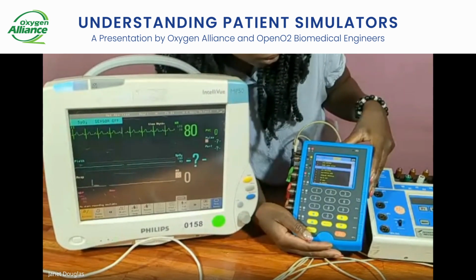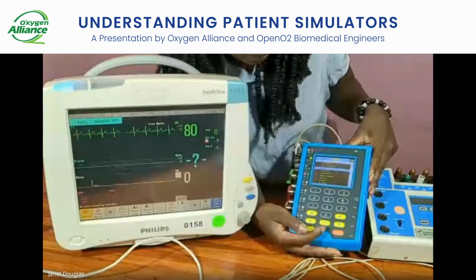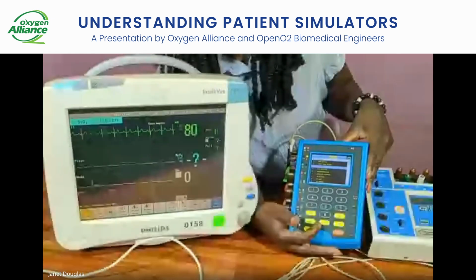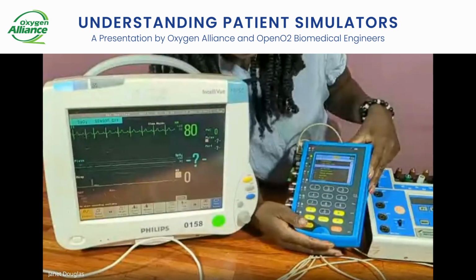You go on number 2, you find ECG rate, and you can also click on what you want. To place OK, you use the yellow one, the yellow banner, which has an arrow. This symbolizes enter. So for example, I'm on 2, which is the ECG rate.